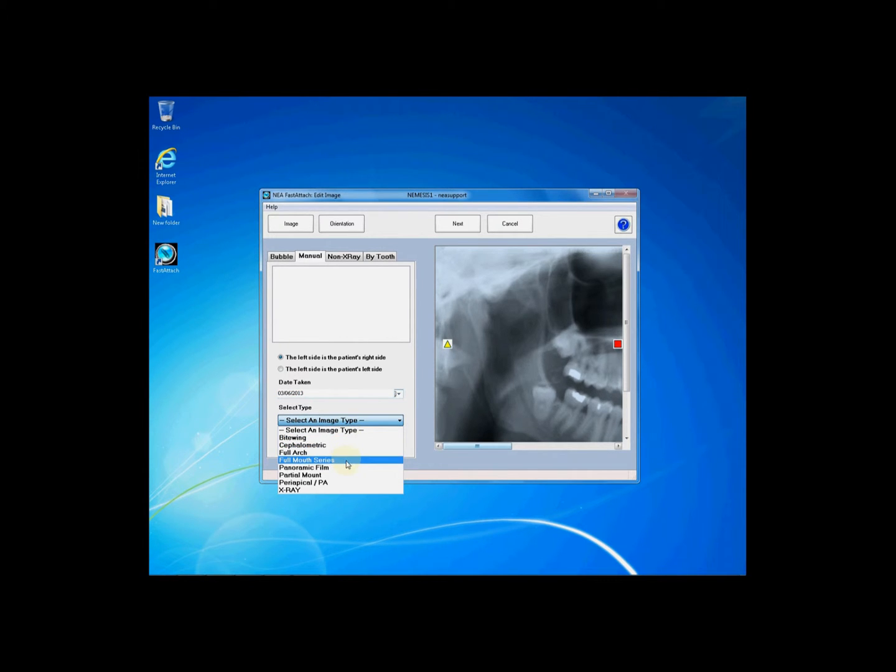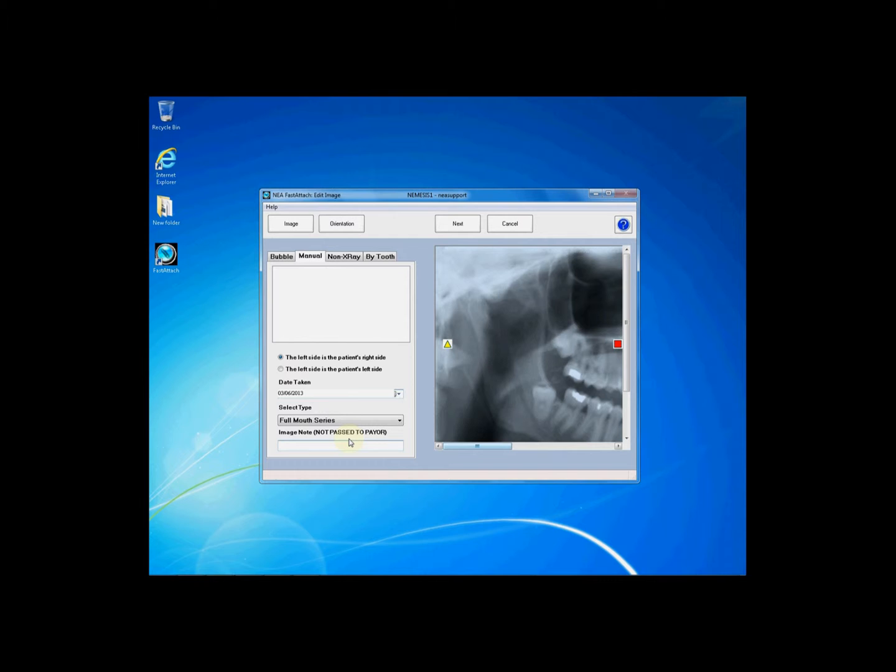You will then need to choose a date taken and an image type. Additionally you may enter an image note that will not be passed to the payer, such as pre-operative or post-operative x-ray.